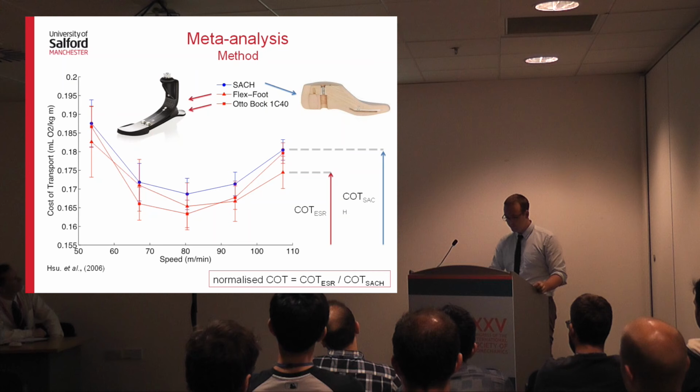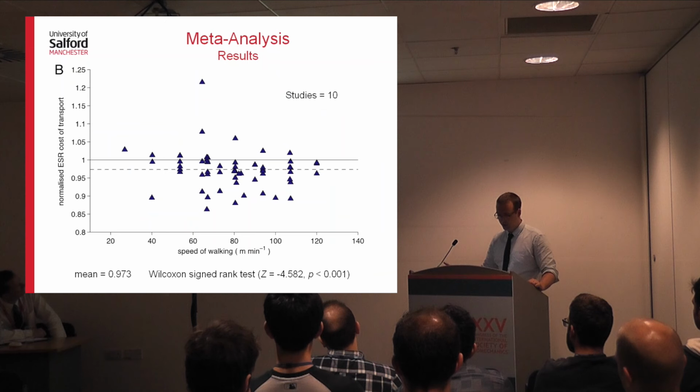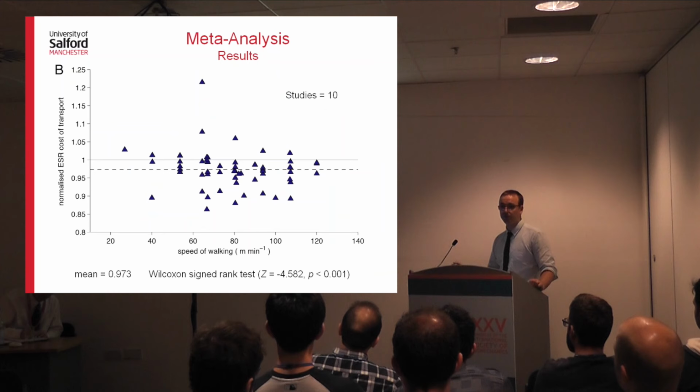So if we carry on to the results, this is kind of the key result from the study. If there was no difference between the ESR feet, so the carbon fiber type ones, and the SACH foot, you'd expect these triangles to cluster around a mean of one. But when we did the statistics, the mean is actually 0.973. So if you like, 97% on average, the cost of walking with an ESR foot compared to a SACH foot.